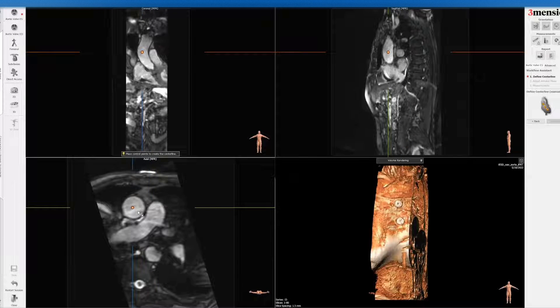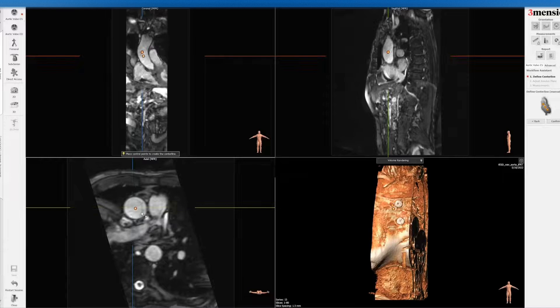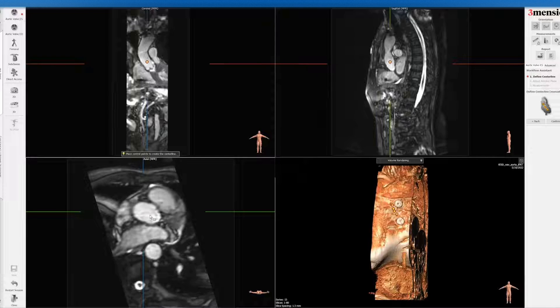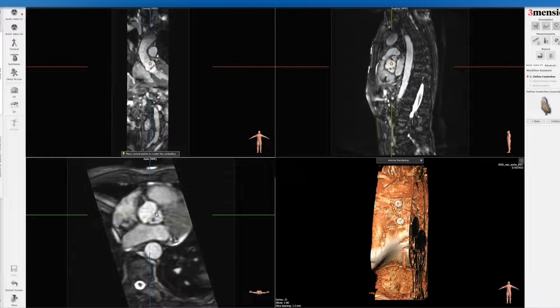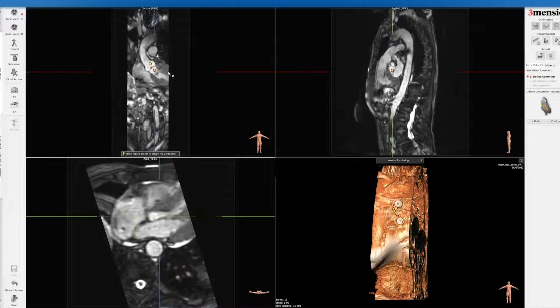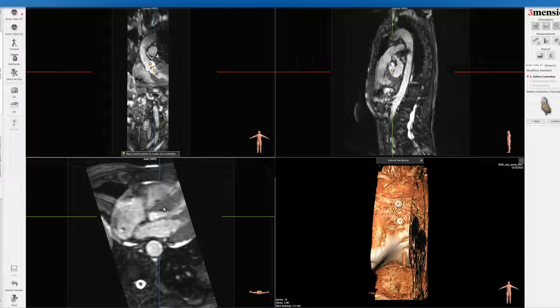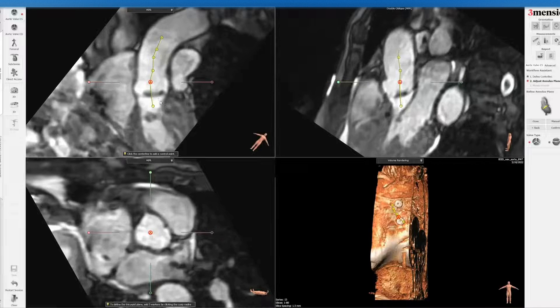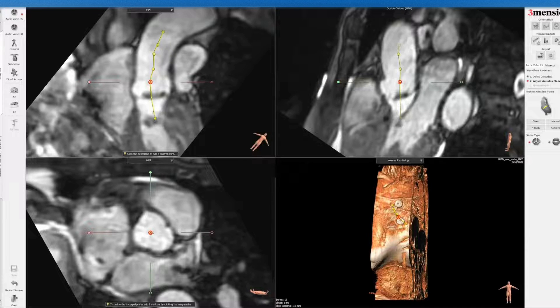You start with the ascending aorta with a dot, and then you come down towards the ventricle, and you just try to identify an approximate centerline going through the aortic valve annulus into the LVOT, as you see here. Once you're done, you click confirm, and you can see this is an approximate centerline of the aortic root.